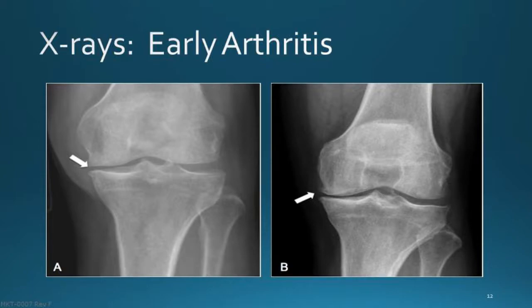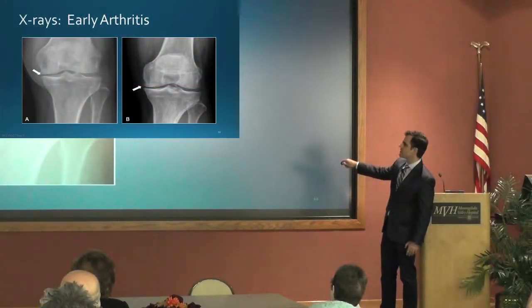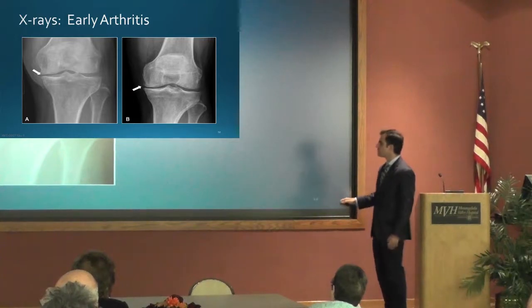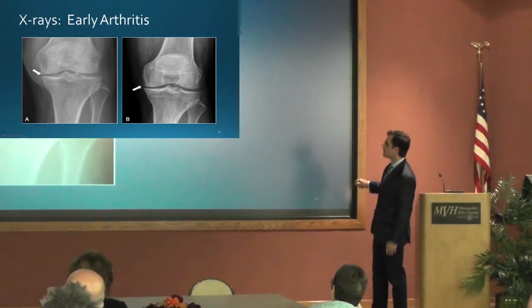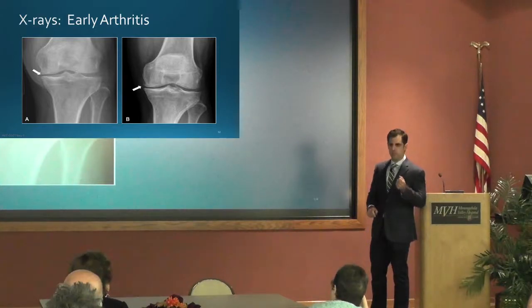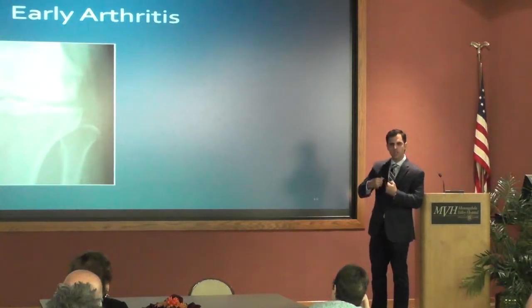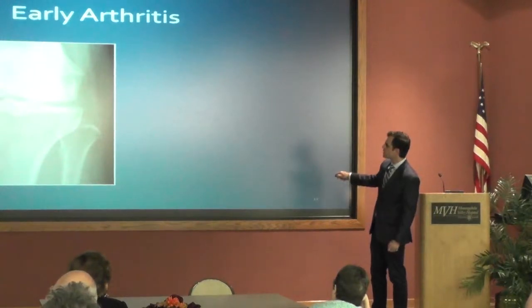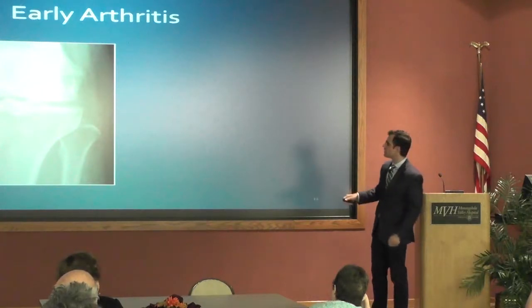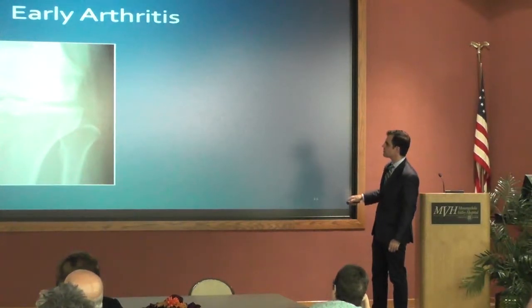So again, top here is the thigh bone, down here is the tibia. The patella, you just see a faint outline of it here. But the patella is the third bone. That's the kneecap on top of your knee, right? Things I look for with an X-ray is the spacing between the bones. X-rays are great at seeing bone. They're not real great at seeing softer tissues like cartilage. Meniscus is like the cushions between the bones. That's why there's a space between the bones, because the bones are sitting on the meniscus. Okay? So I'm looking at the space between the bones.